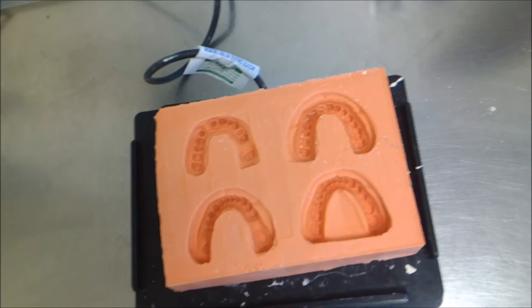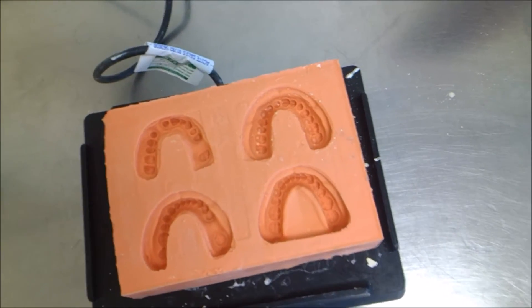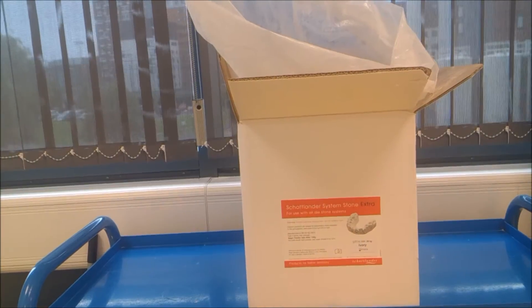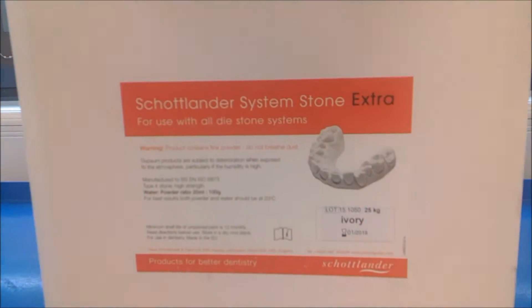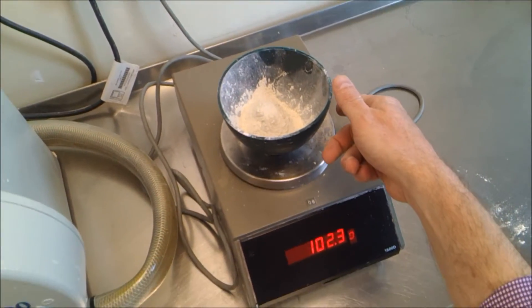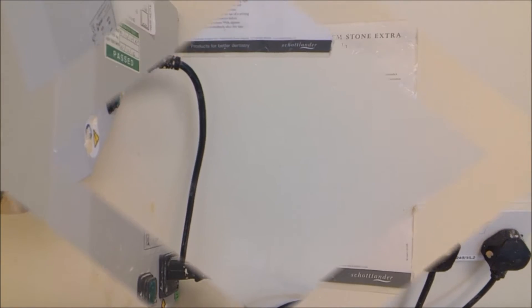Hello and welcome to a short video tutorial where we're going to be pouring a die stone model for crown and bridge. Today we're going to be using Shotlander System Stone Extra, and we're going to be using 100 grams — I've just prepared just over a hundred grams on the scales here. The manufacturer's ratio is 20 milliliters of water to 100 grams of powder.